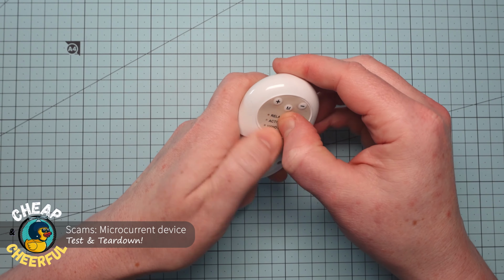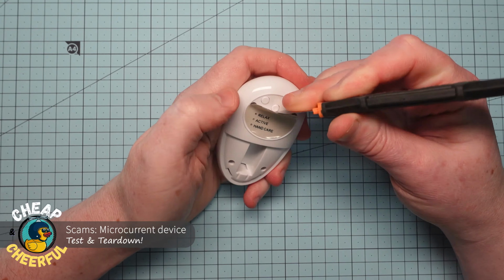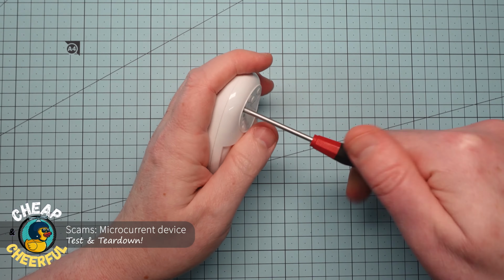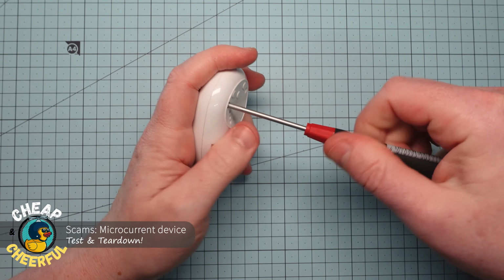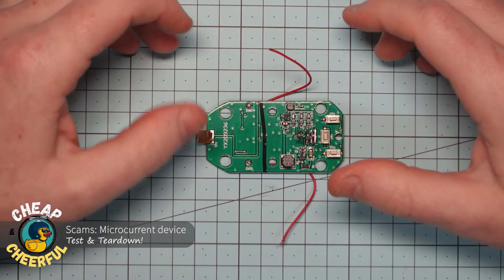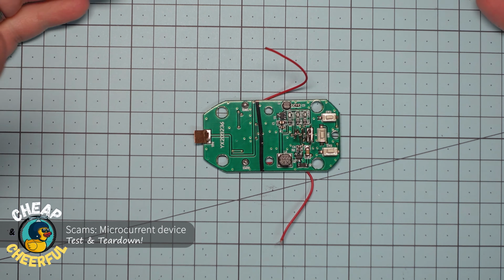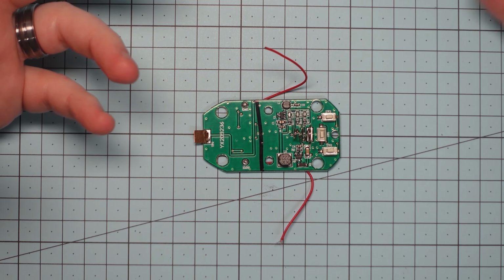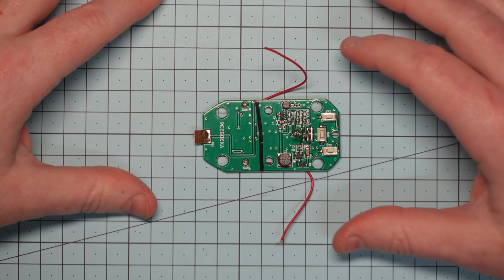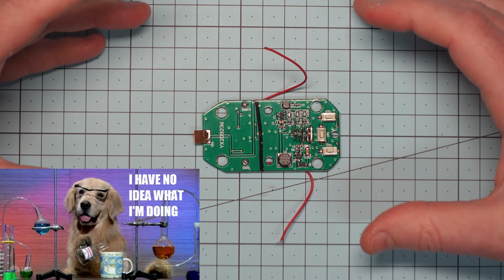Can't feel anything under here. I wonder what's inside this. Is it going to be complex or is it going to be ridiculously simple and cheap? All right, so now we've got it apart. How does it work? Well, I'm not an electronics guru like Big Clive, but I will have a go at explaining generally how it works and what I can see here.